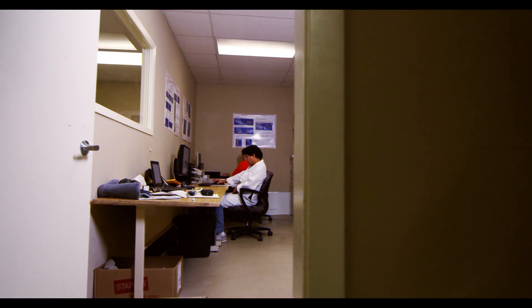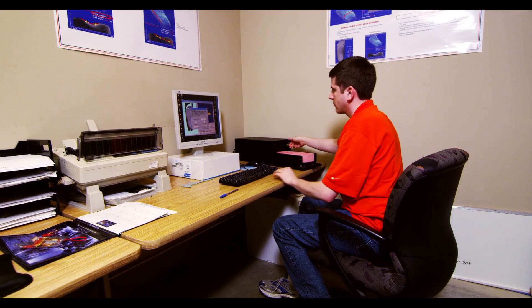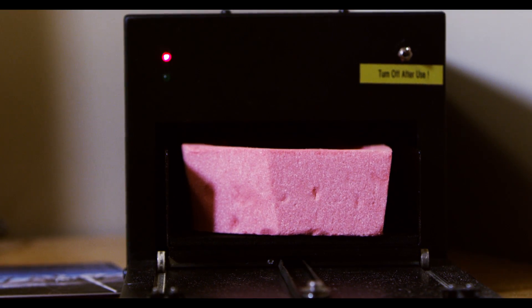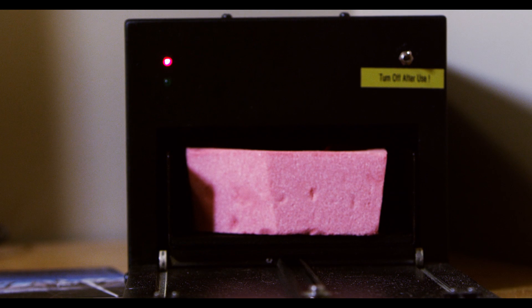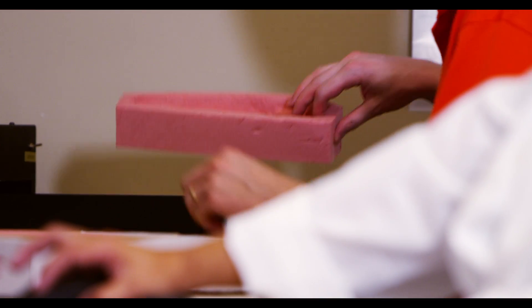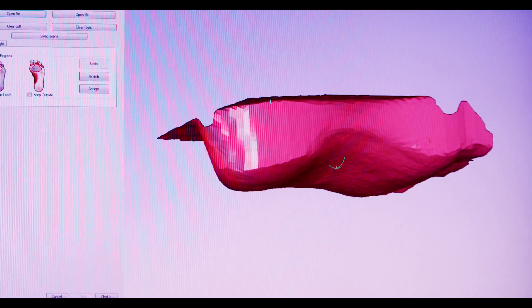Each foot cast is scanned by a high-precision 3D laser scanner. Here we see the laser cast scanner in action. The technician takes the foam impression, puts it in the carriage, and activates the scanner. The laser measures the depth at thousands of points along the cast and produces a 3D digital image of your foot in the position that your clinician wants it to be.